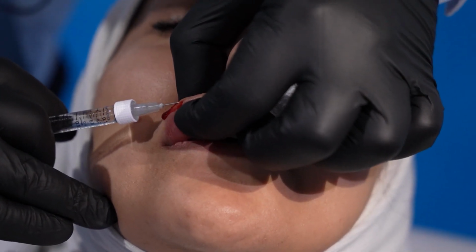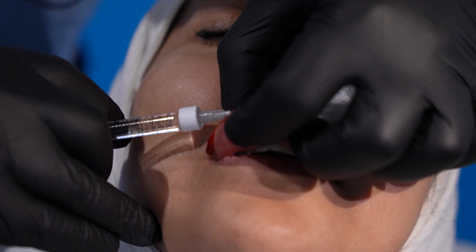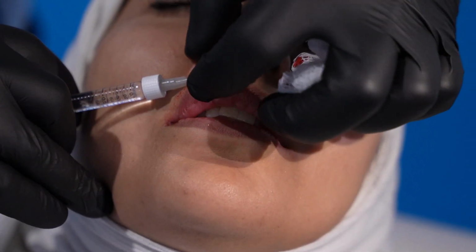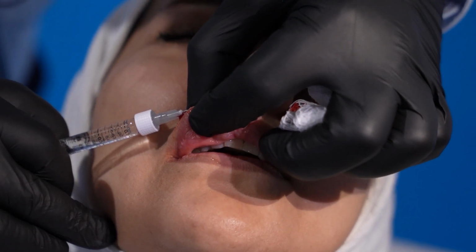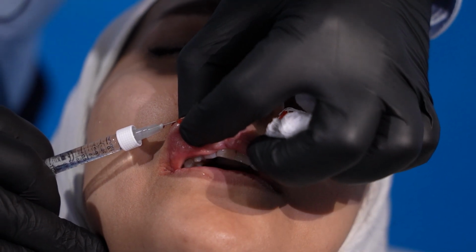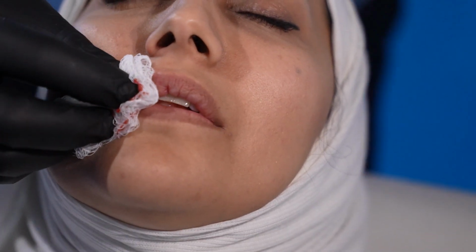We will go through this and just reach the cupid and inject. We'll see.